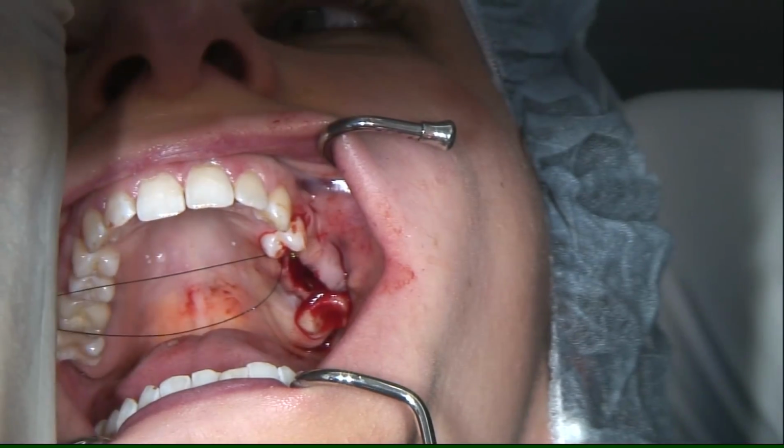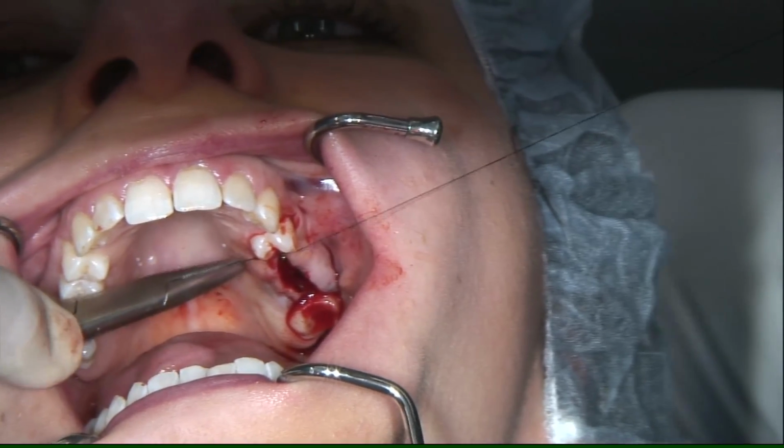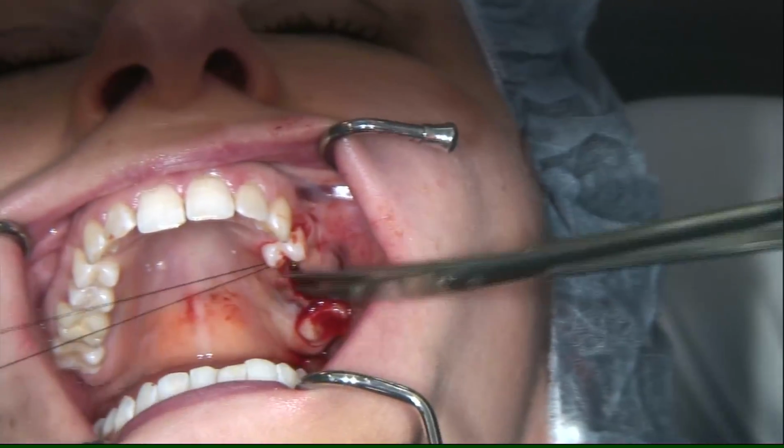Ja, Messer wird gemacht. Wenn zugenäht ist, komplett Lisa. So we are suturing now. Schwer. Hast du noch eine zweite, ne?